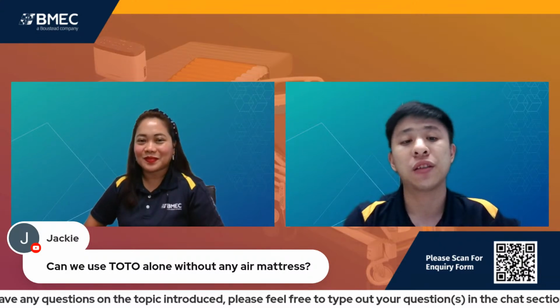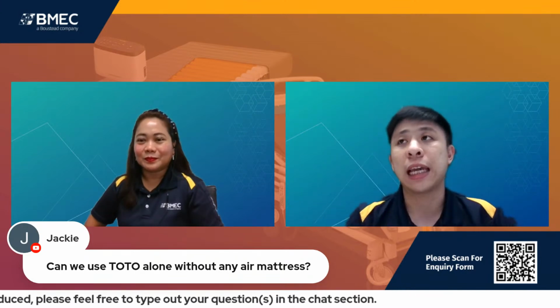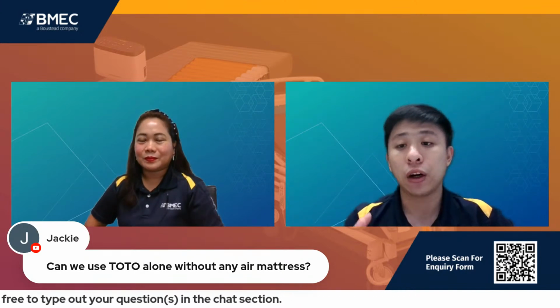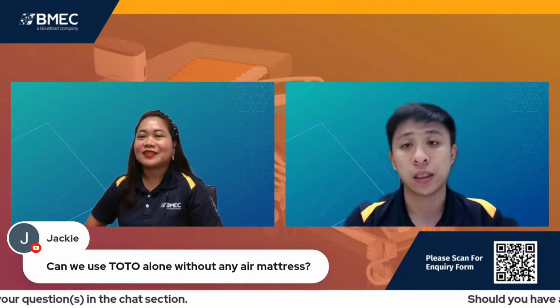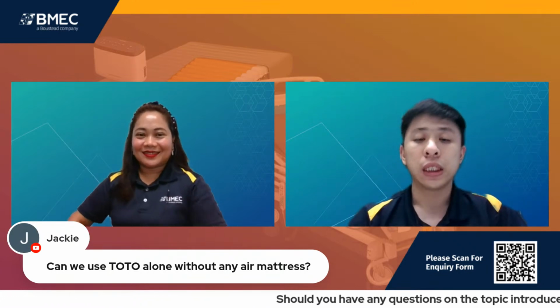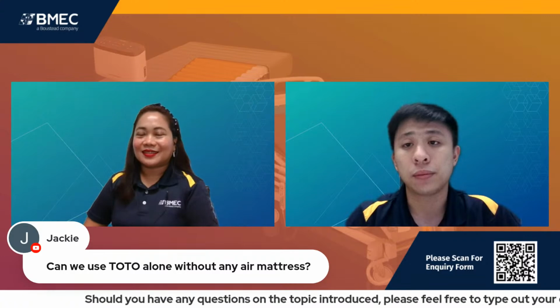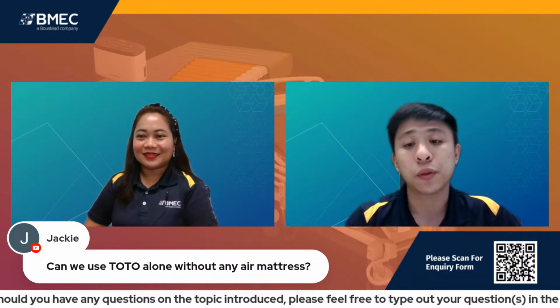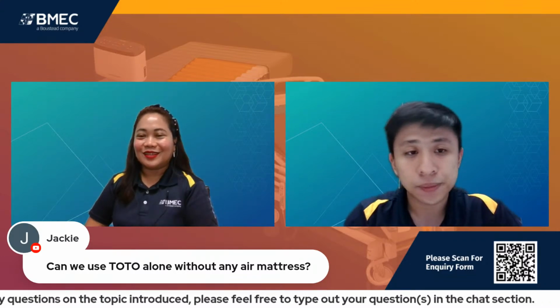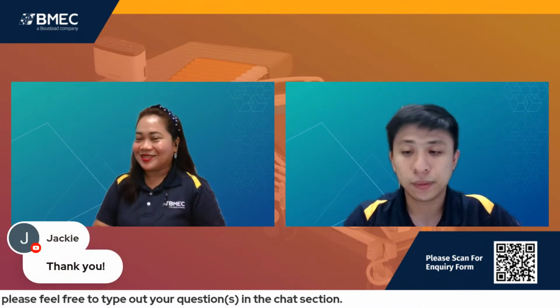However, a layer of mattress is recommended because Toto doesn't have a layer of hard foam surface. It's similar to the air mattress itself, built of air cells inside, but it doesn't have any foam cover below. So, Jackie, you cannot use Toto alone.